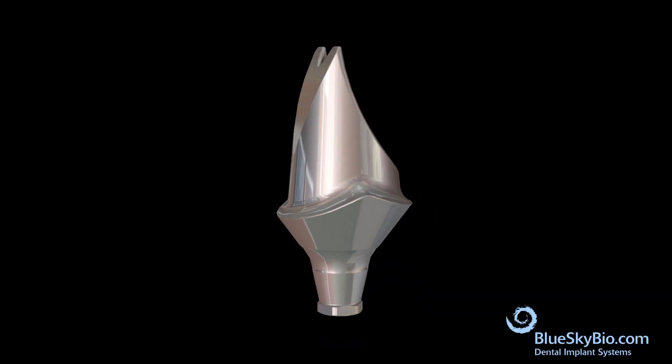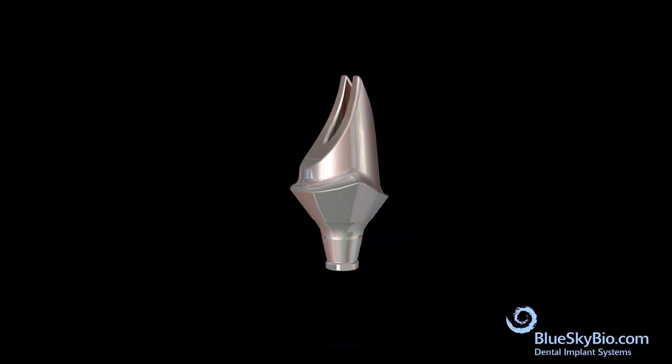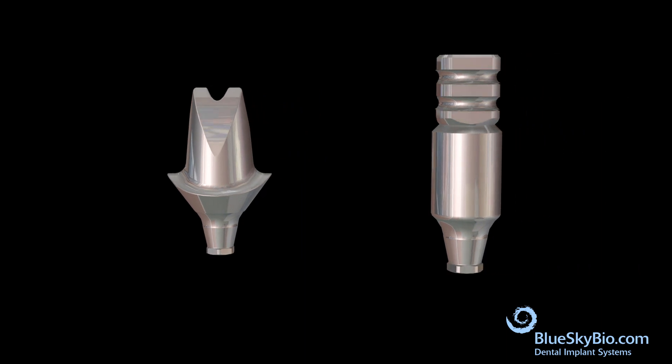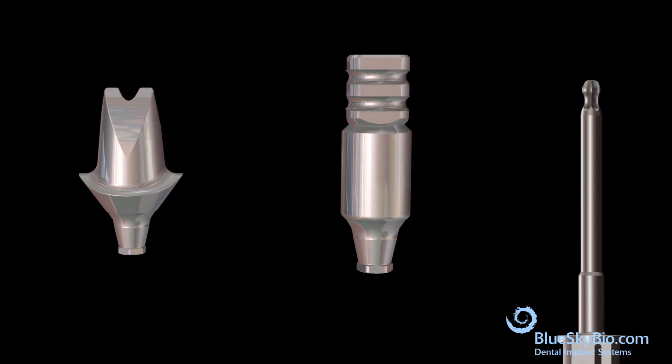This video shows how to utilize a multi-purpose abutment to fabricate a custom abutment with a lingual access hole for an angled screwdriver.